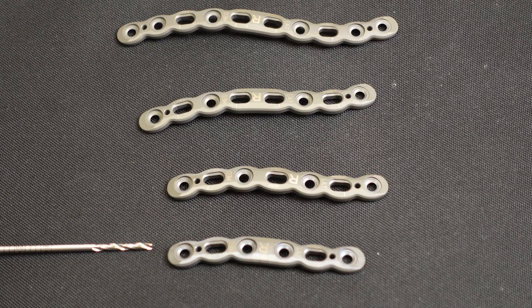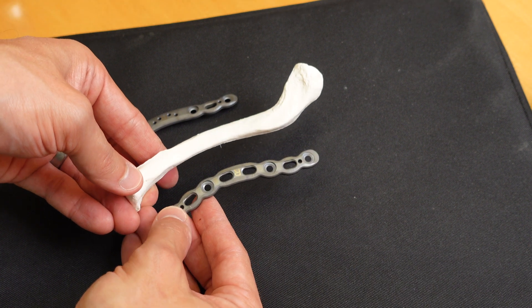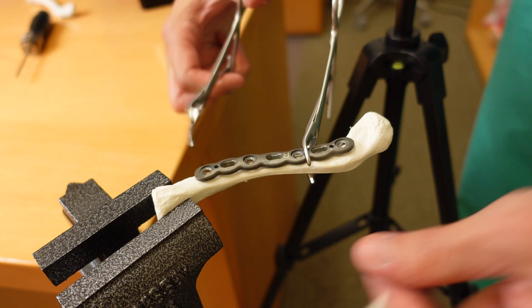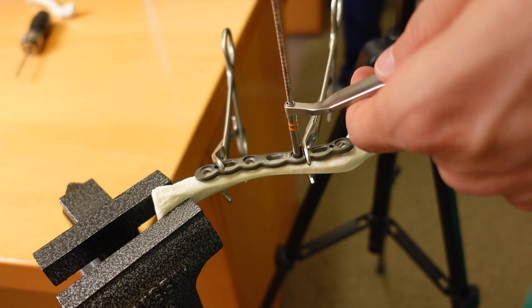The plates come in various sizes and are contoured to the shape of the clavicle to allow them to sit well on the bone and minimize any irritation from the hardware after surgery. Depending on the fracture, the surgeon will select the plate of appropriate length. After the fracture is put back into position in a process called reduction, the plate is clamped to the bone.